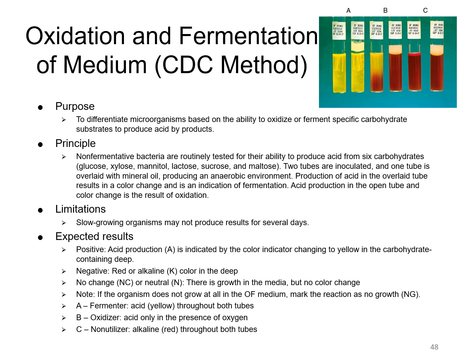With oxidation and fermentation, what you're looking for is to see if these organisms are able to either oxidize or ferment different carbohydrate substances. Depending on which one you're looking for, you would use that particular carbohydrate. For example, we've mentioned with some of our non-Enterobacteriaceae, their ability to ferment glucose. Of course, most of your Enterobacteriaceae do ferment glucose.